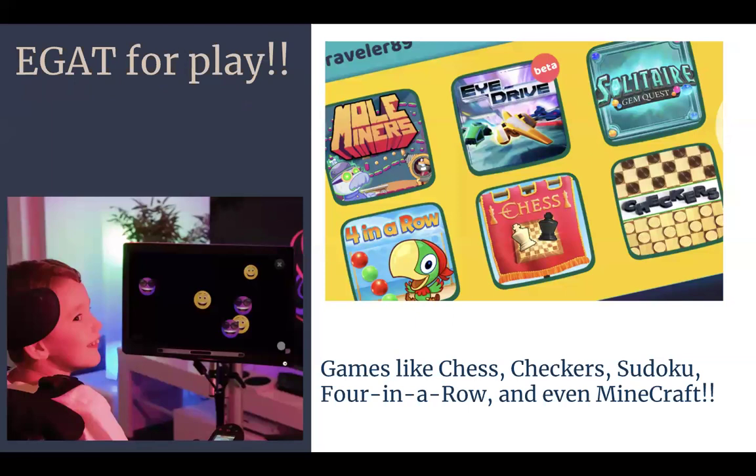Play is really important, and that is a huge advantage for EGAT. It's not just all about instruction and work. There are different sites nowadays where there are games that young people, old people, anyone can play, chess or checkers. There's even a modified eye gaze activated Minecraft.